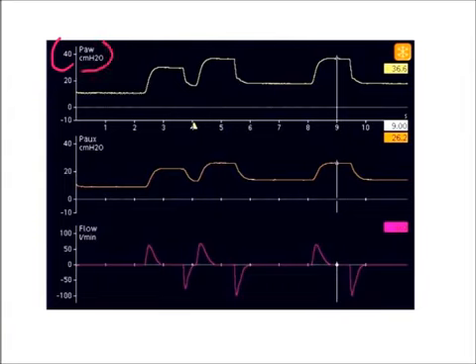So what we did is, during the respiratory phase, we did an inspiratory pause maneuver. We did a breath hold, and we froze the screen. And then we used this control scroller and we scrolled it back to get our measurements. So I'm just going to clear this out of the way. So we look at my peak airway pressure. My measured value over here is 36.6, approximately 37.